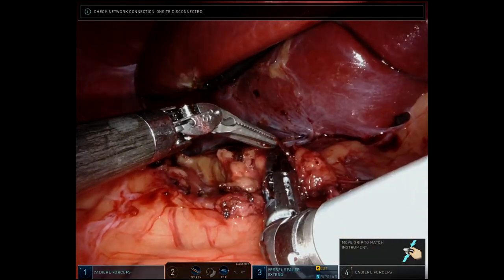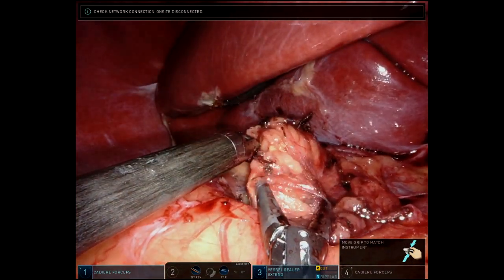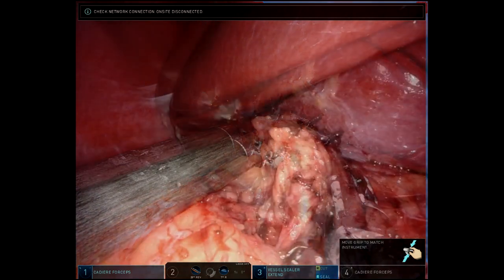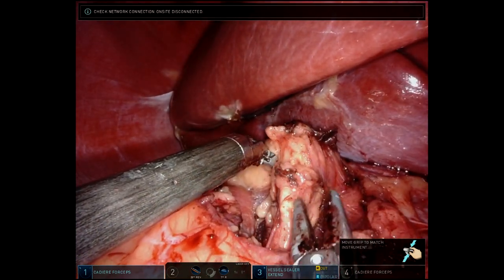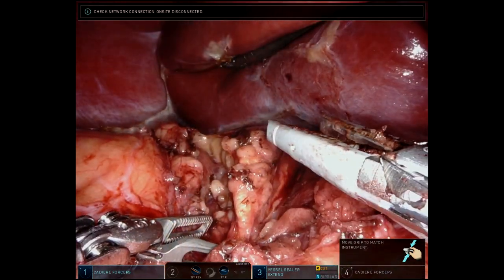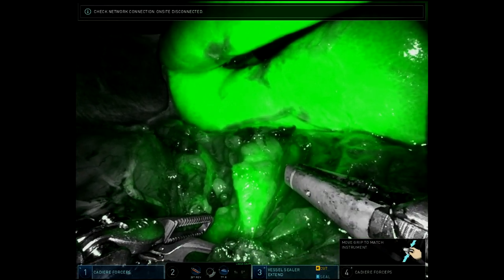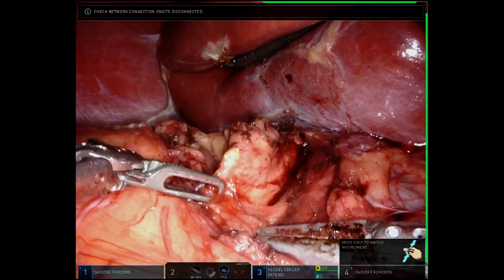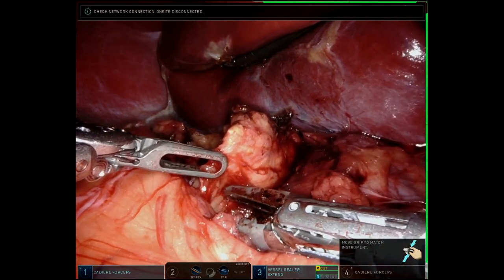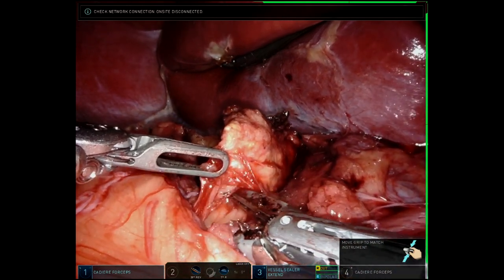Gerota's fascia is then opened medially to begin the medial dissection of the adrenal gland. The improved visualization with the robotic camera is particularly helpful during the medial dissection as the arterial vessels are divided and the adrenal vein is identified. The robotic camera provides an approximately 10 times zoom factor. When seated at the surgeon console, the surgeon sees a three-dimensional image. Firefly is utilized to identify the inferior medial border of the adrenal gland prior to dissection of the retroperitoneal fat at the medial aspect of the gland. This allows the surgeon to confidently dissect the medial tissue without violating the adrenal gland and causing unnecessary bleeding. It also allows the surgeon to identify a safe location to retract the gland without grasping the gland itself.